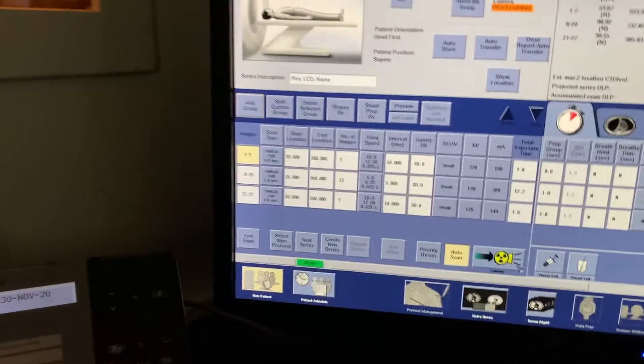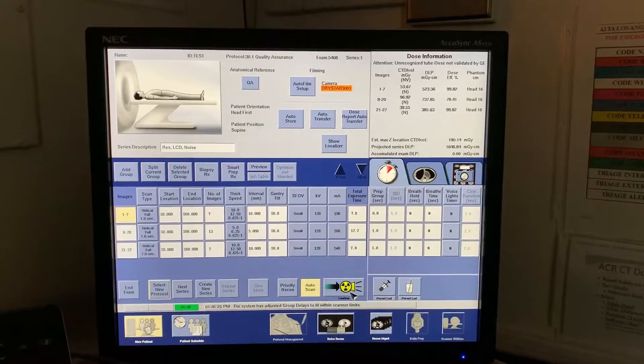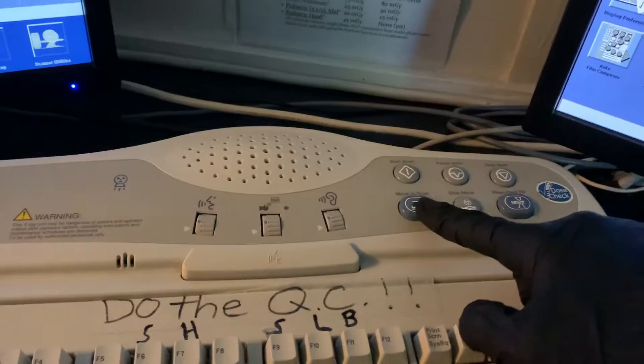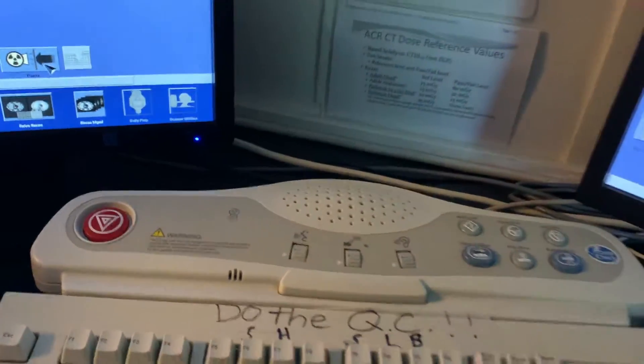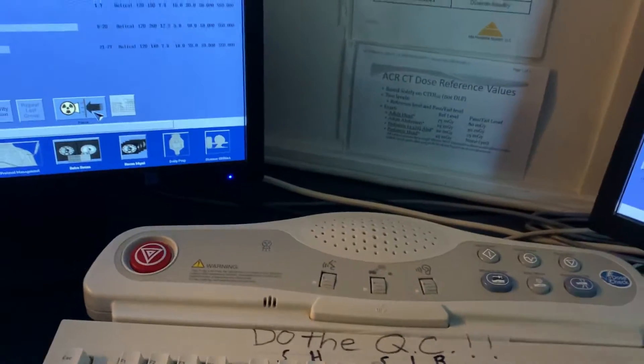Let's go back and click Confirm. Now you'll see the Move to Scan button if you're changing table locations; if not, you'll just see the Start Scan button illuminate. You should be good to start scanning.